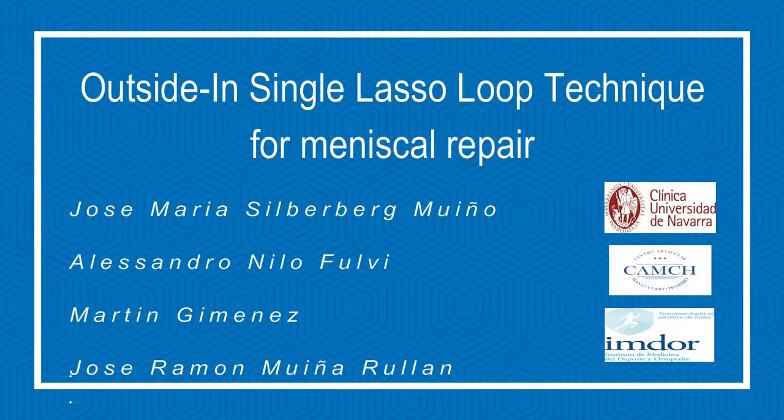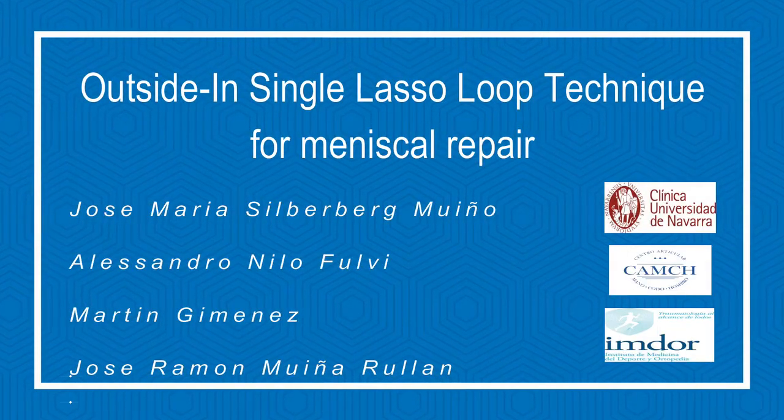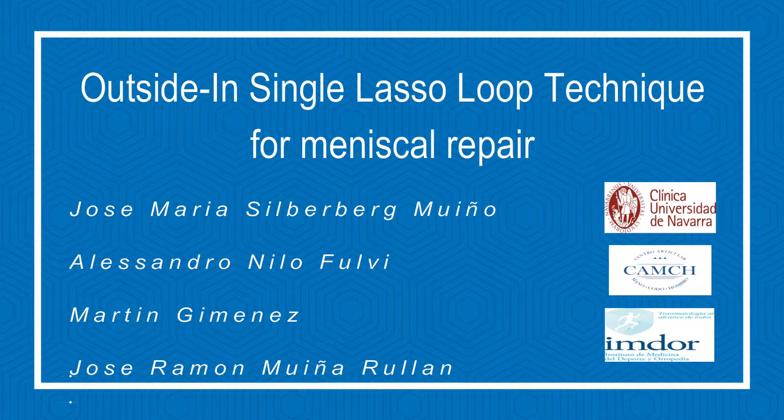In this video, we will demonstrate the outside-in single lasso loop technique for meniscal repair.